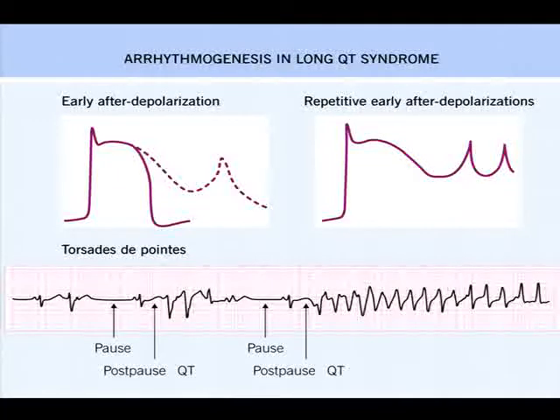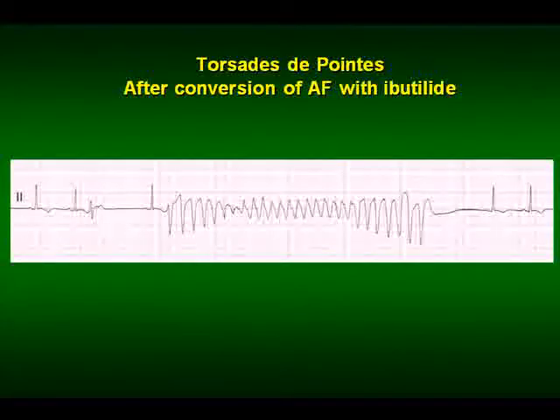This is in the situation where you have repolarization abnormalities like long QT intervals. The theory is that what we get is early afterdepolarization, so that the action potential never fully recovers. You get oscillations, and if the oscillations, which are called early afterdepolarizations, are sustained, you get this type of rhythm, and we call it torsade de pointes, the turning of the electrocardiogram and the twisting. This can either be sustained or go on to ventricular fibrillation. It's a very malignant rhythm, and you have to recognize it.